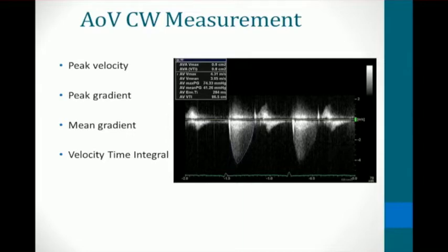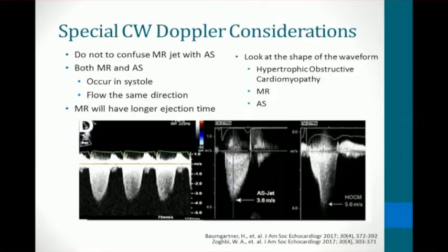One is because it will make the patient's pathology worse and possibly send them to surgery before they need it. The second reason, these patients are typically followed closely with serial echoes, so the next sonographer is going to be pulling their hair out to try and match a false measurement.